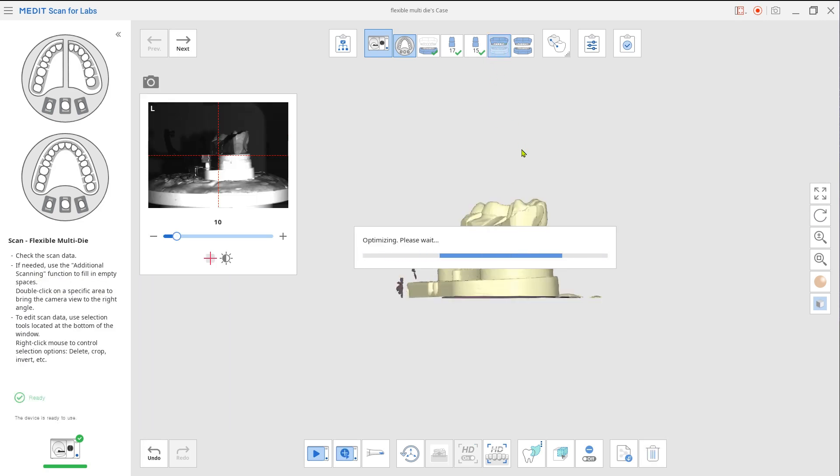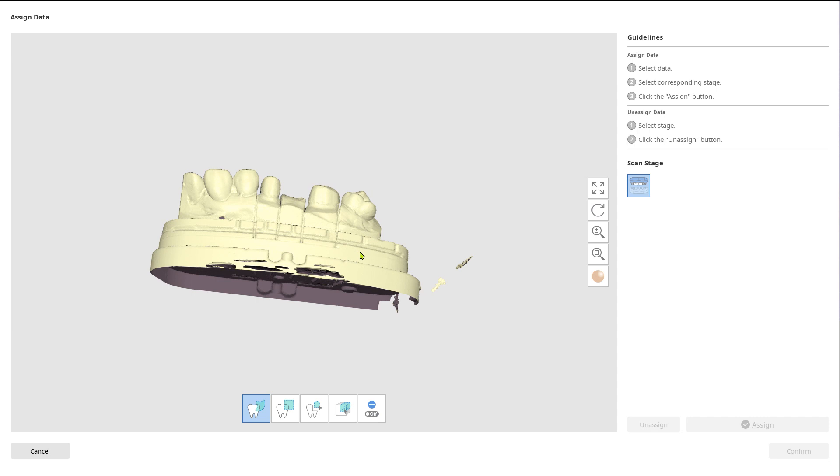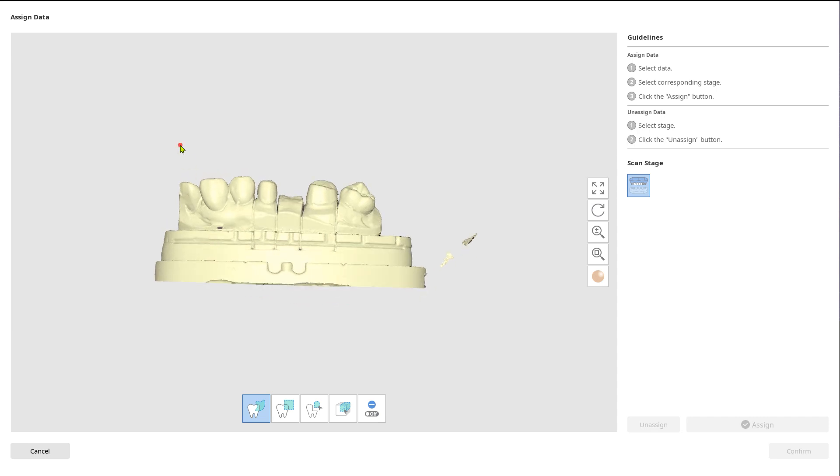Go to maxilla and assign the data to maxilla base and prep teeth from the right scan stage.